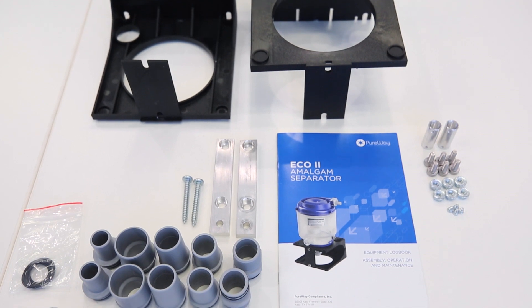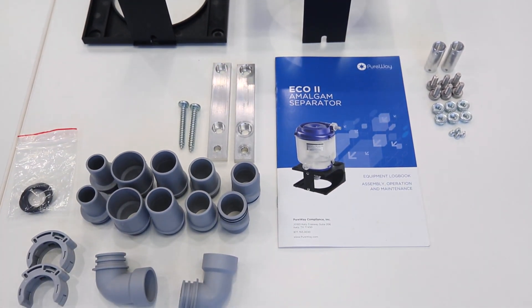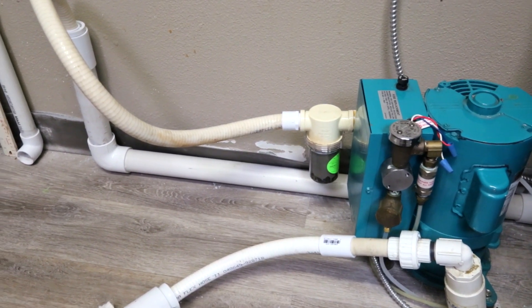The Eco2 comes with numerous fittings for multiple piping options. However, you may need to find alternative fittings from a local hardware store, depending on the plumbing in the dental office.